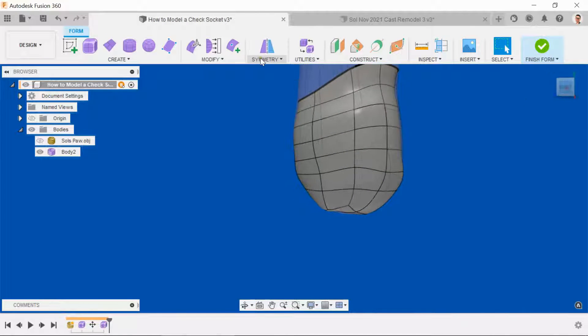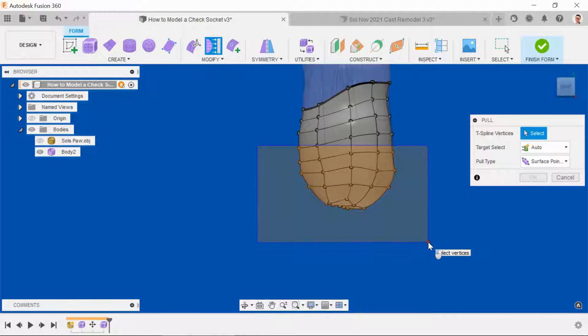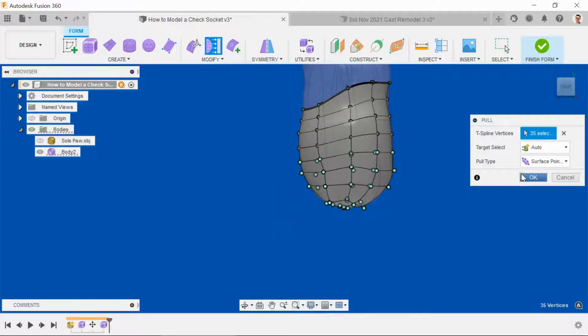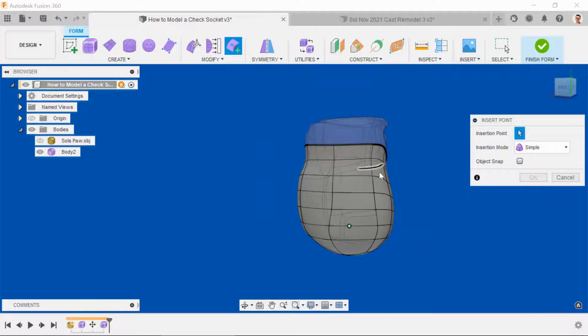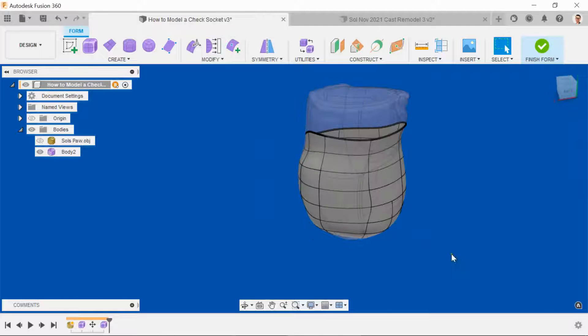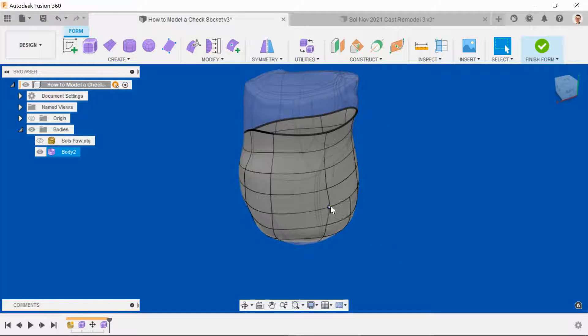So again, turn to the side, select the pull command, and pull all of the new points to the T-spline. Sometimes it's a question of just adding a new point, and sometimes it means manipulating things directly.